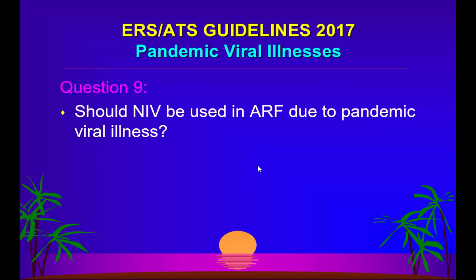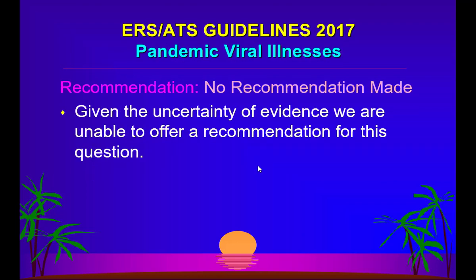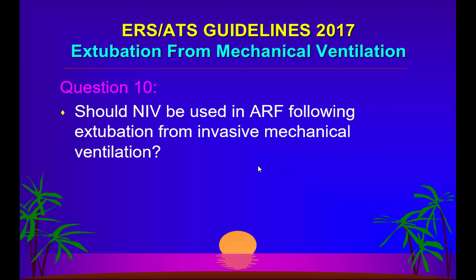In pandemic viral illnesses, no recommendation made. You can try. But you have to be careful, especially in H1N1 cases. If you are using NIV, there are more chances of spreading the risk of infection. So these patients, the contact persons have to take proper precautions. Now for extubation, this is something again very interesting.